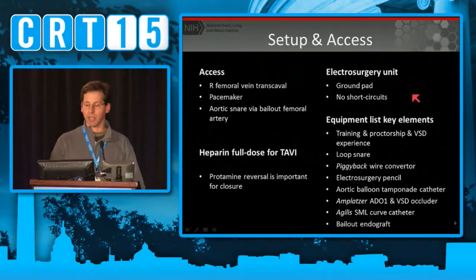We place an electrosurgery unit, a BOVI. It's important to know where the ground pad is placed so that there are no interposed EP devices or metallic hips.